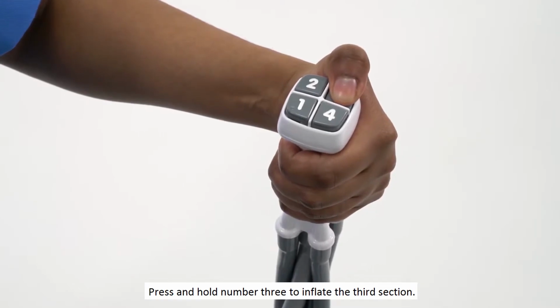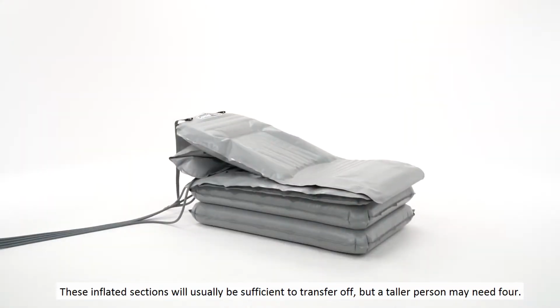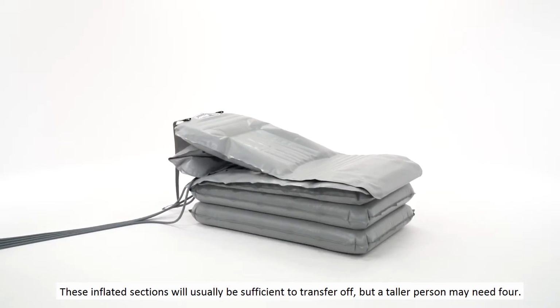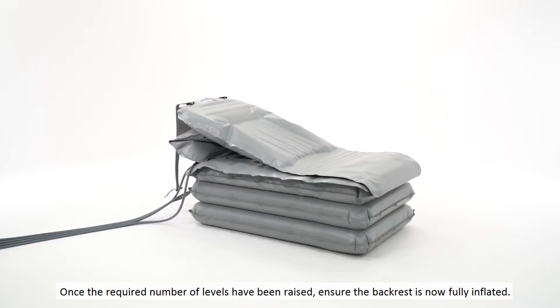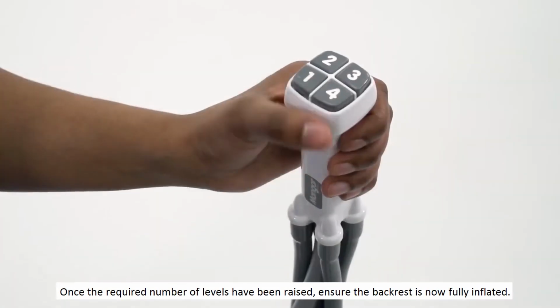Press and hold number 3 to inflate the third section. These inflated sections will usually be sufficient to transfer off, but a taller person may need 4. Once the required number of levels have been raised, ensure the backrest is now fully inflated.